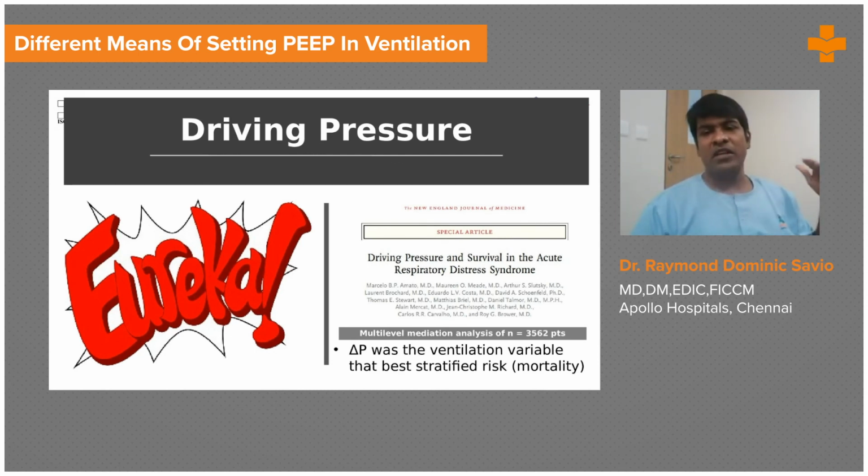These are all different ways of titrating your PEEP. When you do your PEEP titration, look at all of these, but have the PEEP FiO2 table as a starting point for the novice.